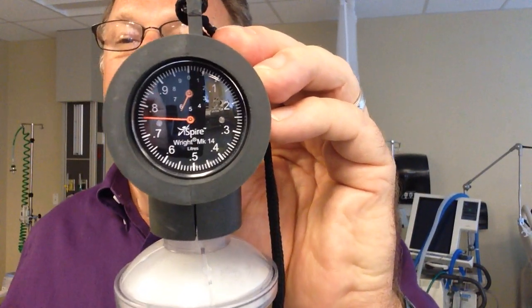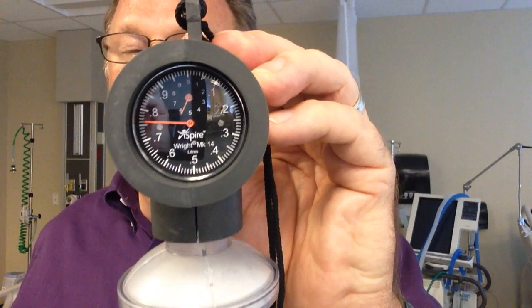So I blew out 5.76 liters, or 5,760 milliliters. Now, according to the lecture, if the patient is blowing out less than 10 to 15 cc's per kilogram of ideal body weight, and we will get into calculating ideal body weight in the next couple lectures, then that is a critical value.